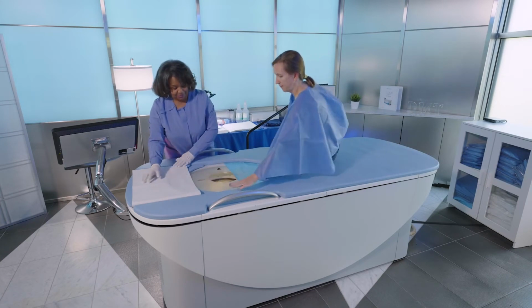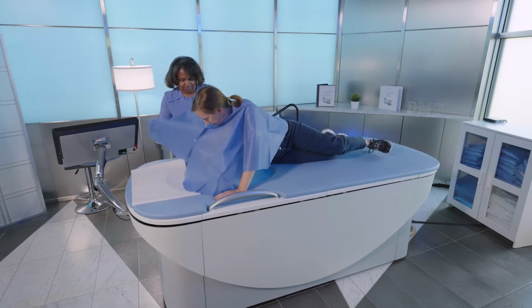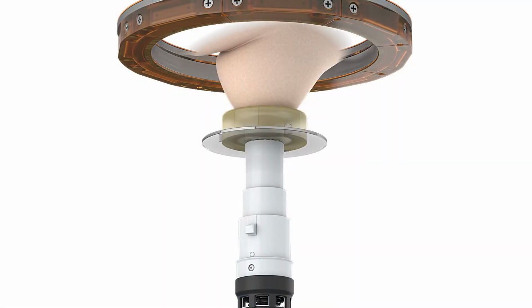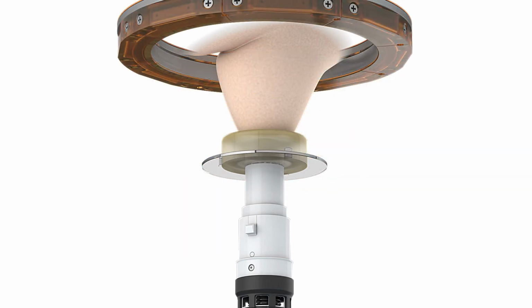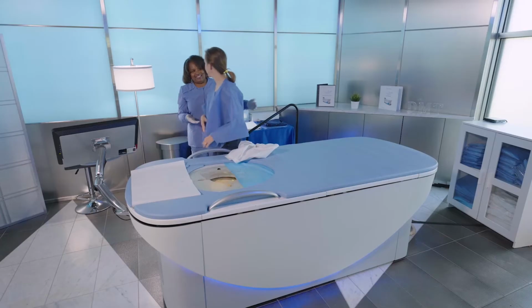A woman would come in, she has a very discreet gown over her, so it's not like other exams where you feel exposed, you feel discomfort. She simply lies down, and with a technician, and it doesn't have to be an ultrasound technician or a mammography technician, it can be a trained person who just gently guides the woman into the hole in the table, which then gets engaged by the secure breast interface, which I can explain in a minute, but that just gently extends the breast into the warm water so we can get the full scan. The scan starts at the nipple and only takes about a minute or two to scan all the way up to the chest wall, and then the breast is exchanged for the other breast and the process is repeated. And so literally within 10 minutes of walking in the door, you're walking out with the entire breast scanned and then to be reconstructed and interpreted.